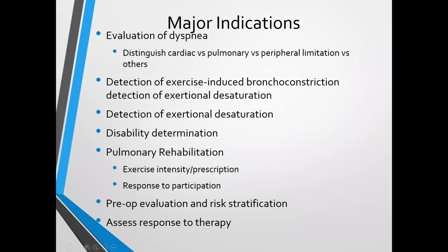Disability determination, what I've alluded to earlier, and maybe there's a real exposure. They want to see how disabled the individual is. What is their limitation to exercise? At what point during the protocol, during the increase in stress load, do they either have indications where they can't continue, or again, they go into what's called an anaerobic threshold, which I'll talk about. Pulmonary rehabilitation to screen patients pre-pulmonary rehabilitation.